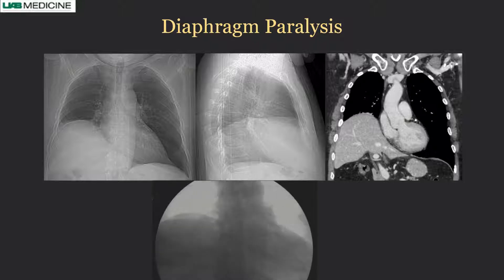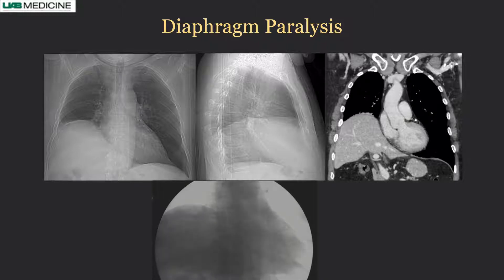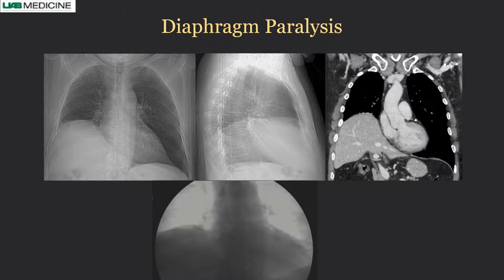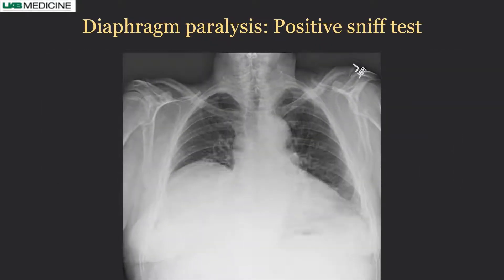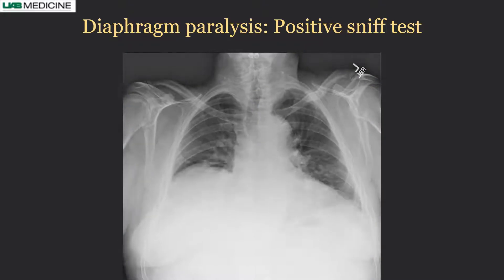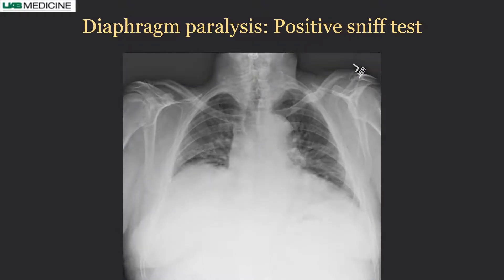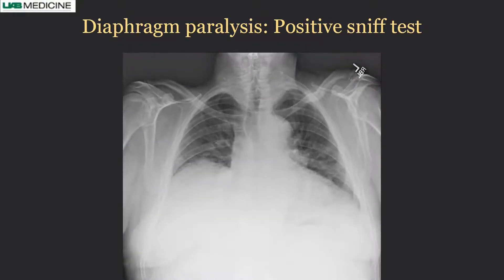On conventional imaging with chest fluoroscopy, you can see the sniff test is positive. The paralyzed right diaphragm goes the other way when the patient sniffs, compared to the left side. Here is the sniff testing with DDR showing the same finding — the right hemidiaphragm goes up when sniffing compared to the other side.